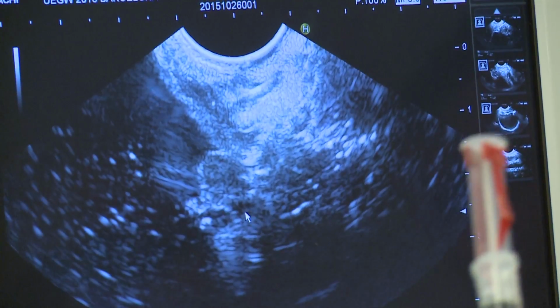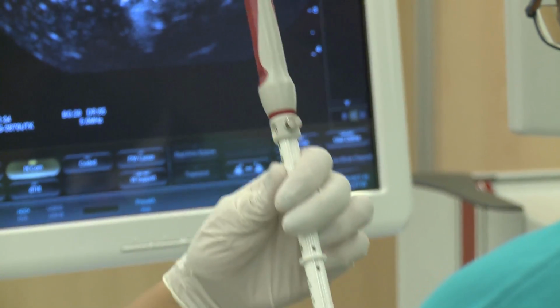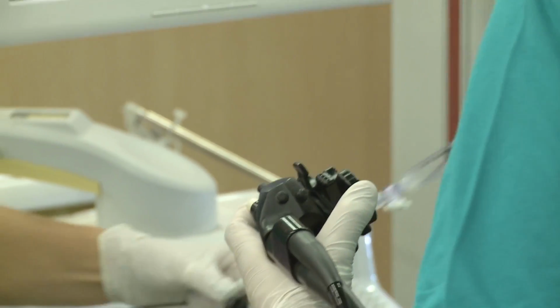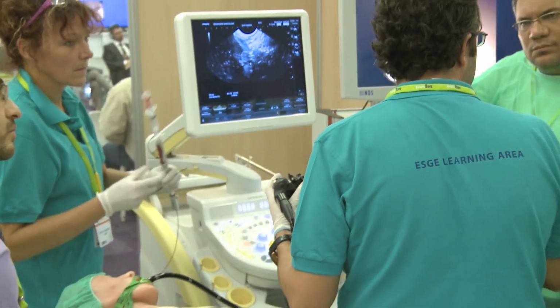Please, always close this and remove. And that's an FNA. Once you identify the lesion, it's easy. Okay?